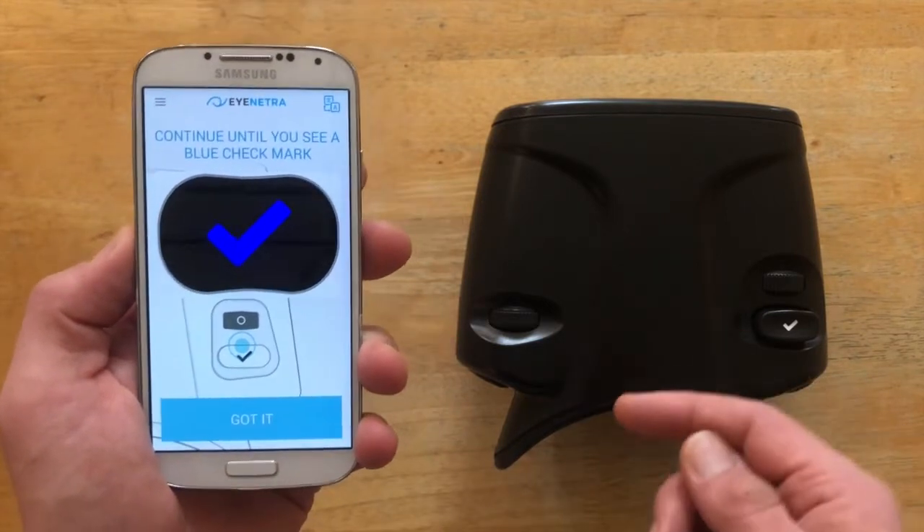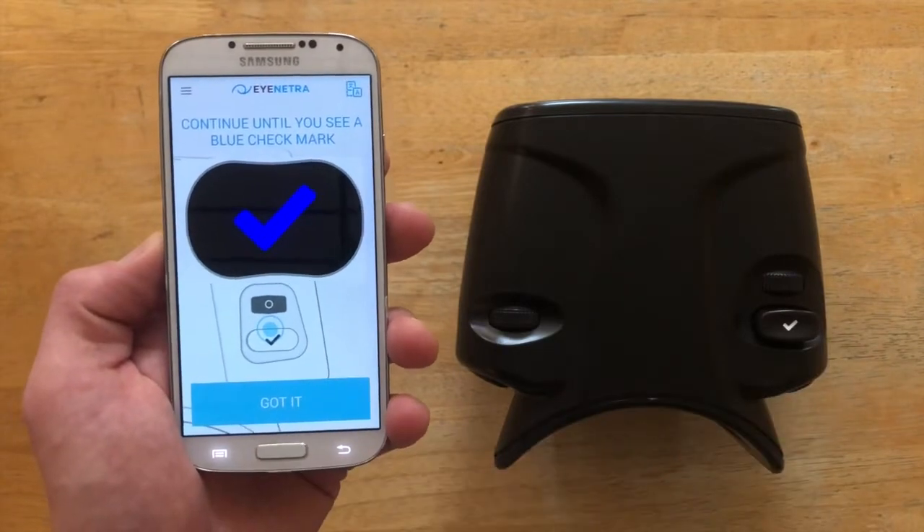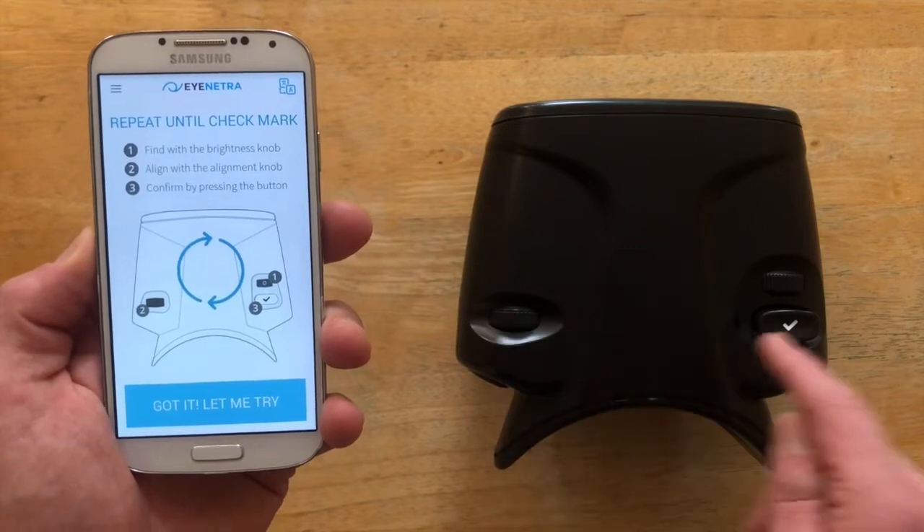The patients will repeat those same three steps until a blue check mark appears on the screen. So again: find with the right knob, align with the left, and click to confirm.